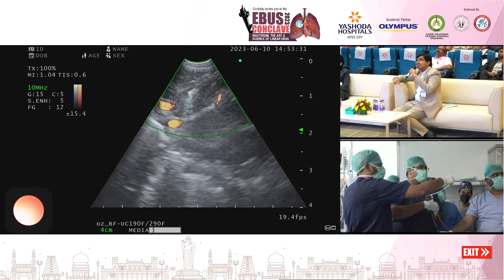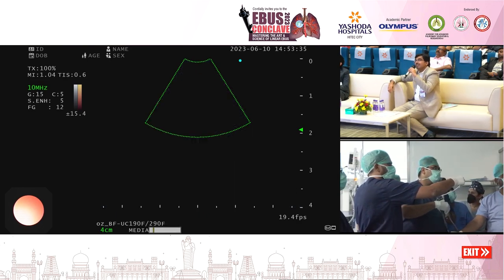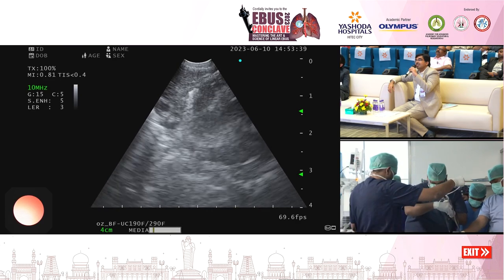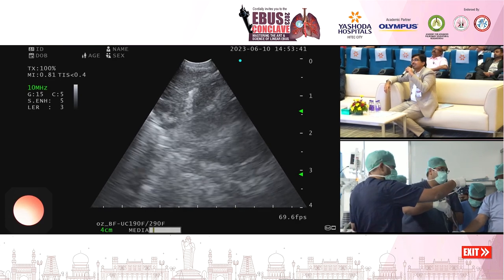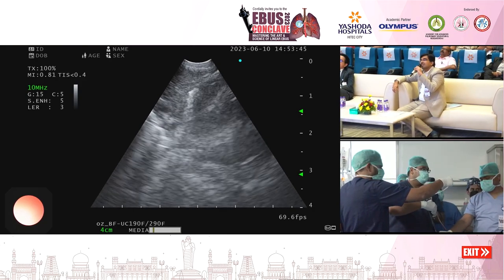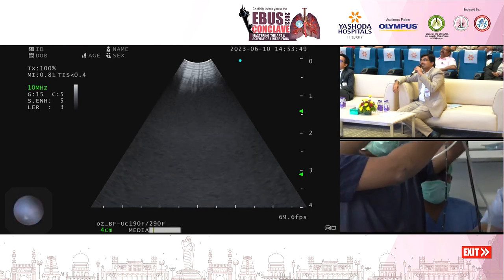Through a track he has gone inside, again checked with the Doppler. Yes, now remove Doppler. Now I'll be activating it for about 4 to 5 seconds. The first pass, generally activate for about 4 seconds and see the size of the biopsy piece. Now I'll pull it off en bloc.